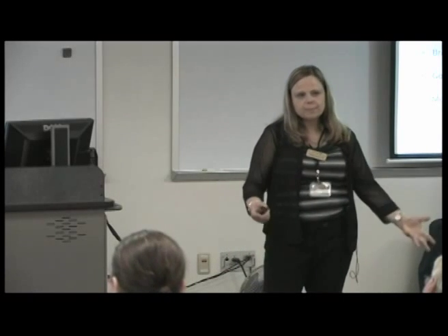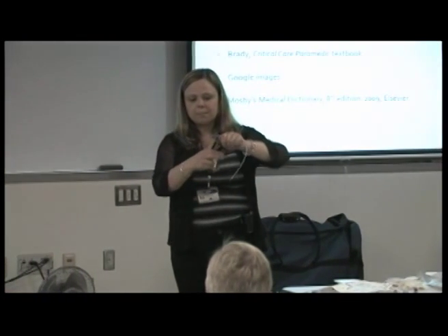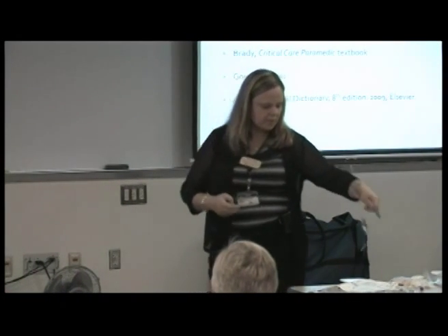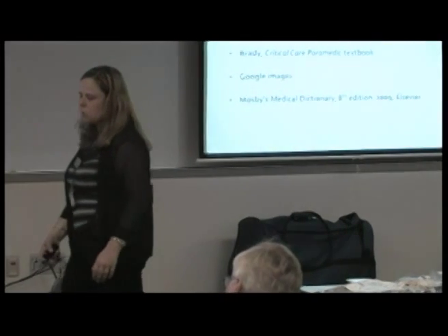We can always ask the patient about the different colored lumens and which one to access. In the ICU setting, they're pretty specific. The brown one, they want the central venous pressure monitoring done on, versus some of the infusions, but usually on the med ports or the different devices at home.